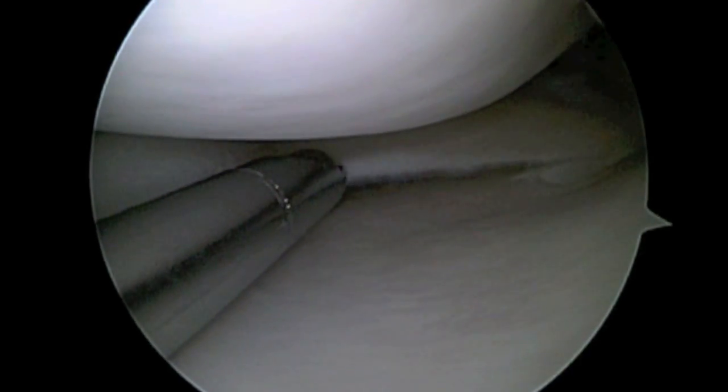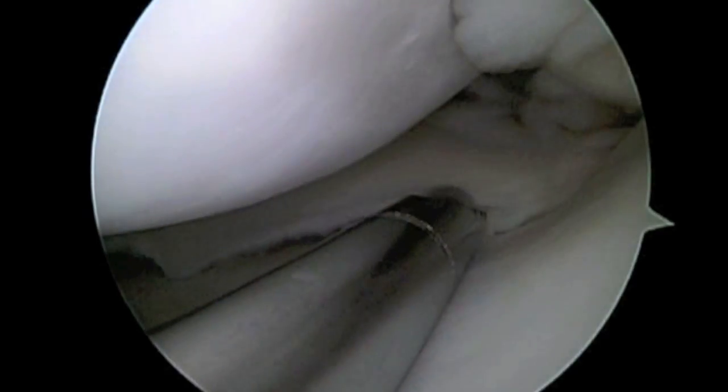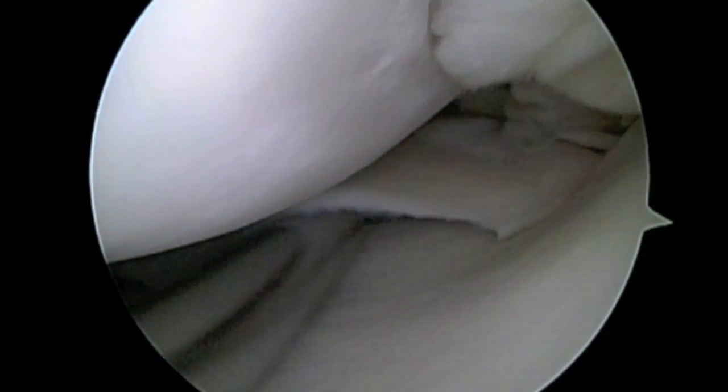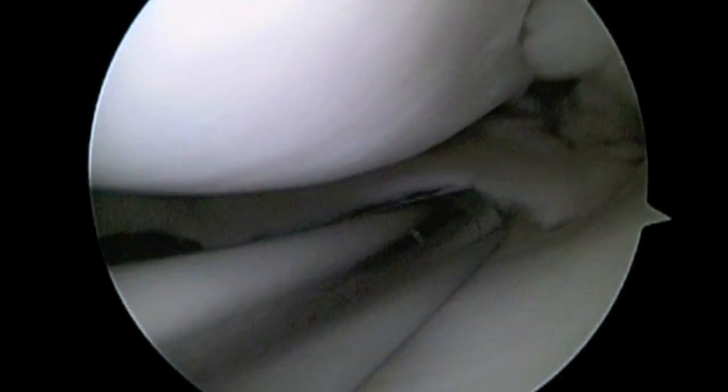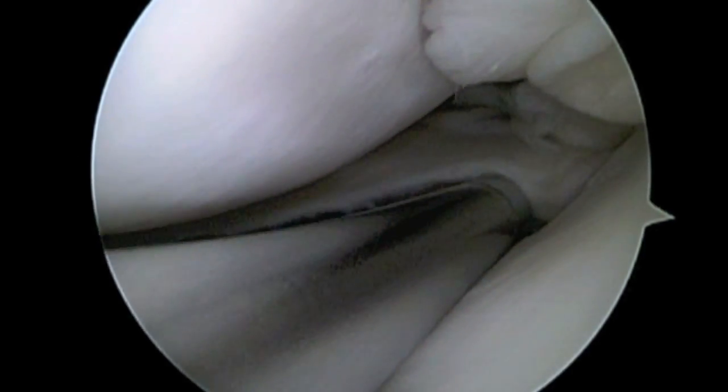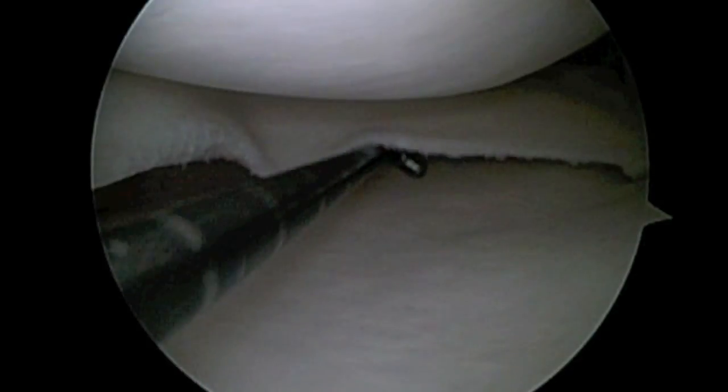The shaver is used to contour and taper the edges of the tear, and also to smooth the uneven, rough surfaces. After this is done, the meniscus is inspected, and the fragment that's torn is completely removed.